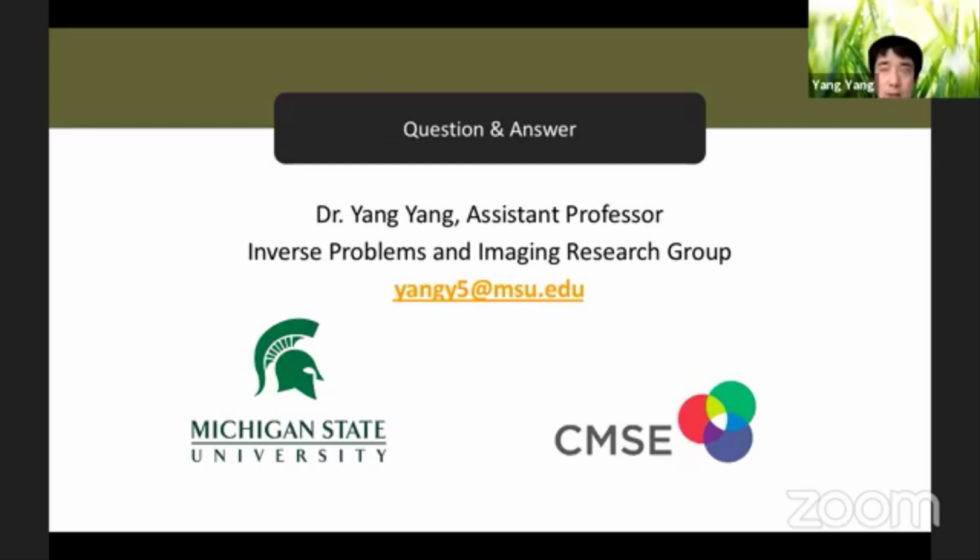There are also other emerging techniques, for example, techniques that combine these standalone methods, like combining X-ray CT with ultrasound. The advantage of the combination is that some techniques have better resolution, some others have better contrast, and by putting them together, you will be able to have an image of both high resolution and high contrast.